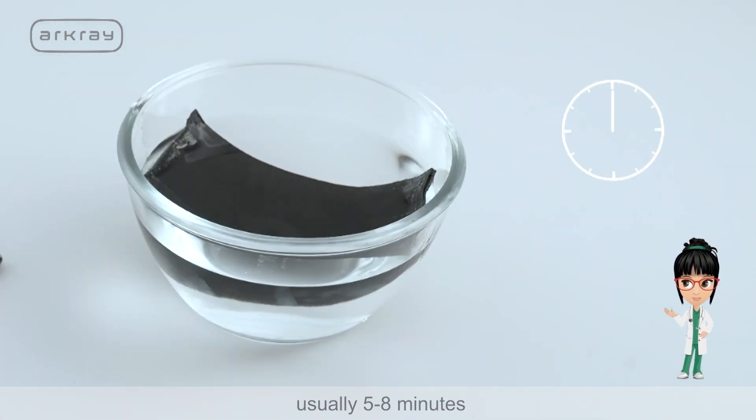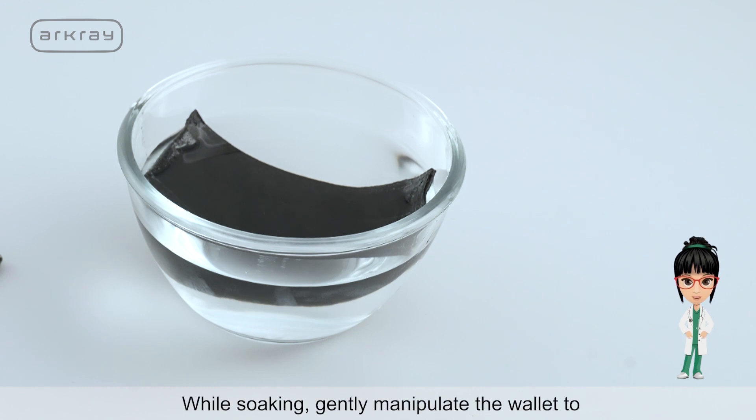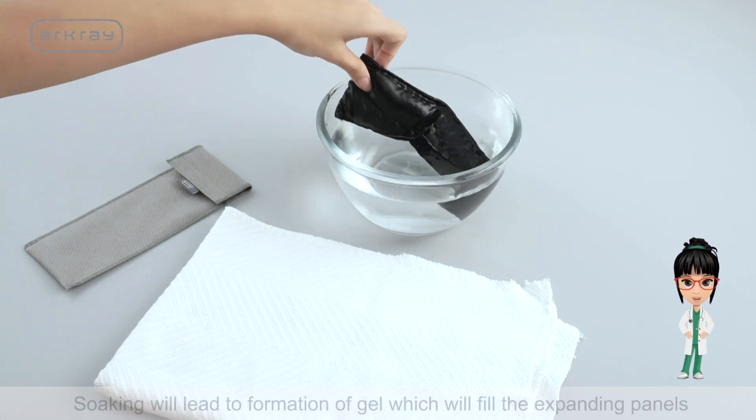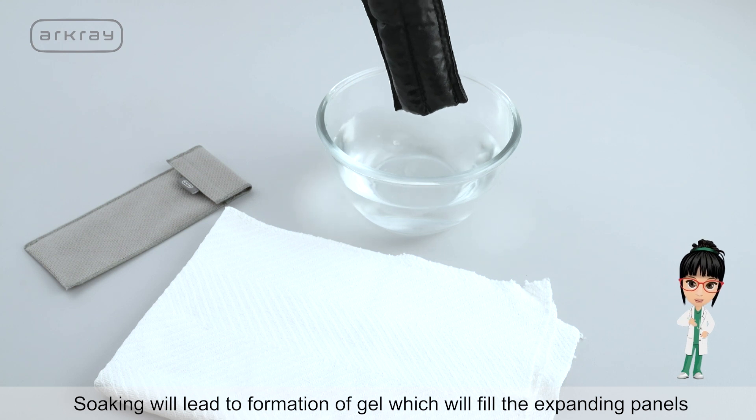The soaking time will vary with the size of the wallet, usually 5 to 8 minutes. While soaking, gently manipulate the wallet to spread the crystals evenly throughout.